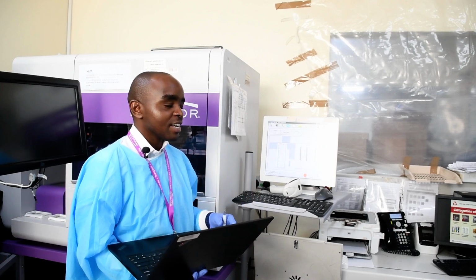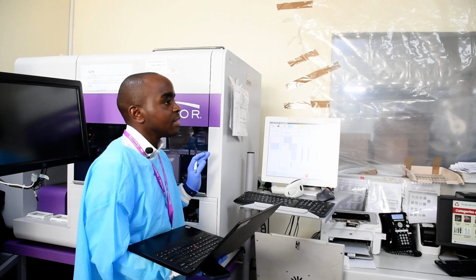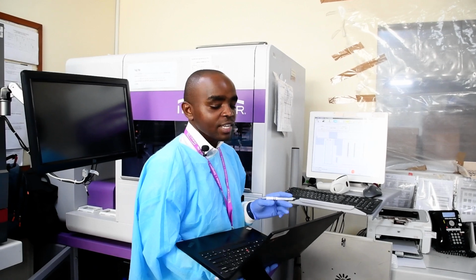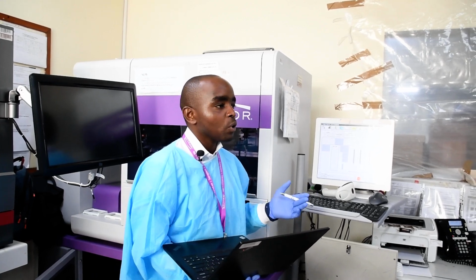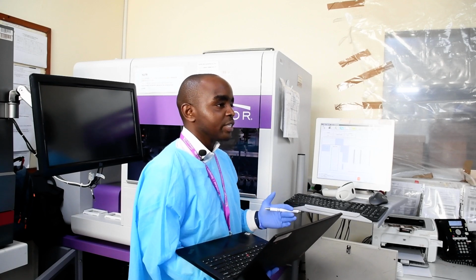It does not detect the anti-A and anti-B antibodies in O blood, since the donor cells are washed to remove the plasma or serum. So you realize there is a washing step, and this anti-A and anti-B will be missed in that major cross-match.